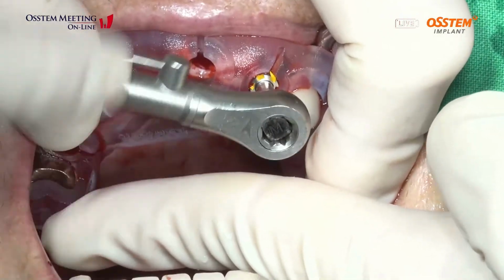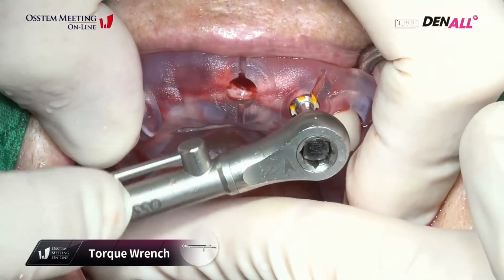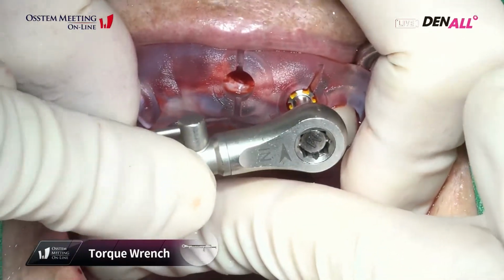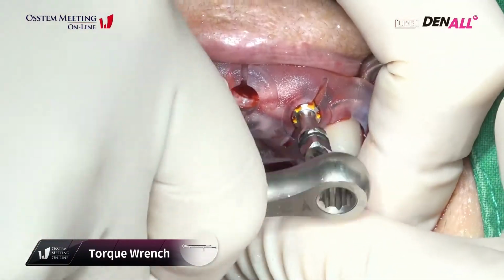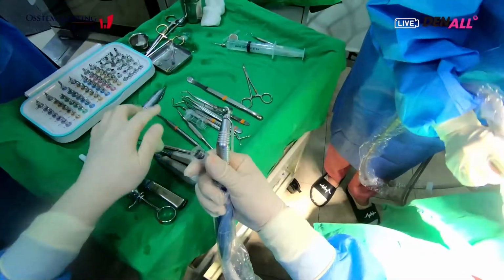Yeah, bone quality, stability is quite good. Okay. And I will leave this pilot driver to support the surgical template.